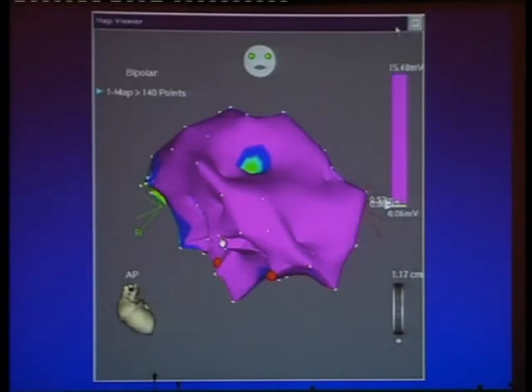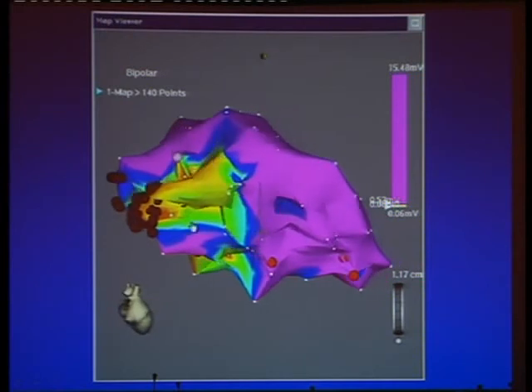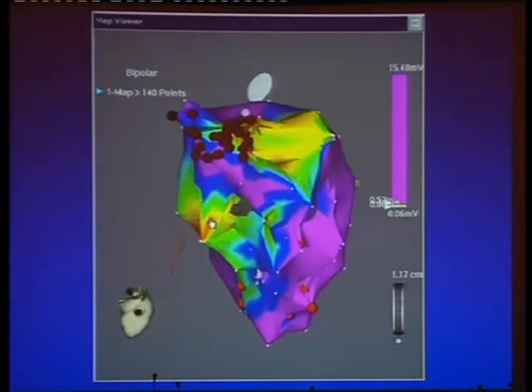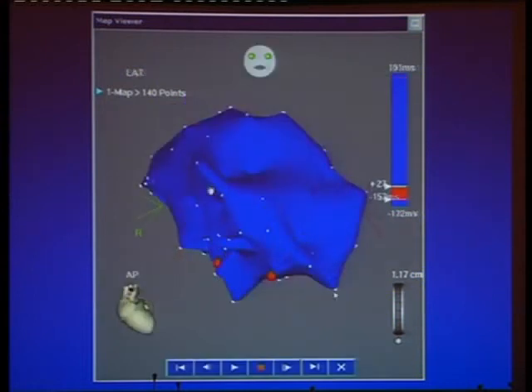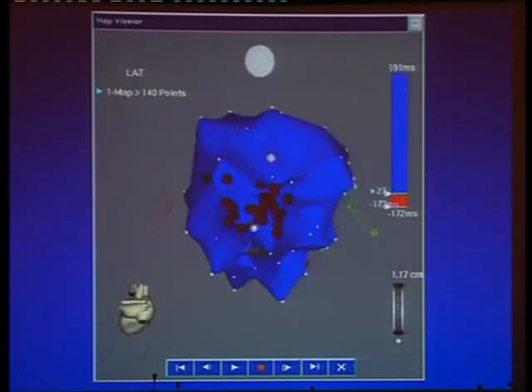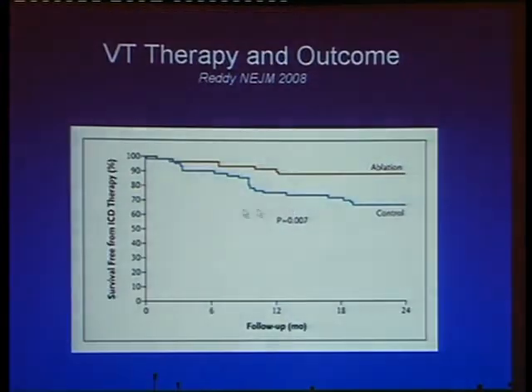And here's the kind of thing, because his ventricular tachycardia was so slow, we actually mapped him during VT. This is a voltage map, and then you'll see next should be an activation map through the left ventricle. So this is the slow area, anterior view of the left ventricle during VT. And you can see there'll be slow conduction coming back through this posterior scarred area, breaking out there, coming around, and then zigzagging through here to break out again the next beat. So ablations in this area of the return path sort of ended up in a good outcome.